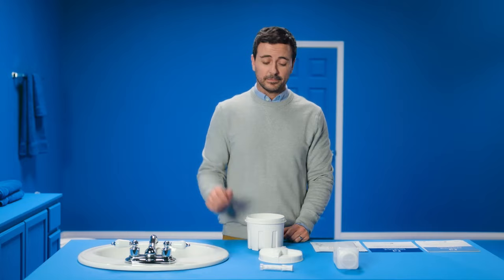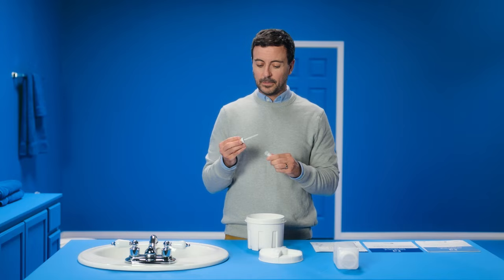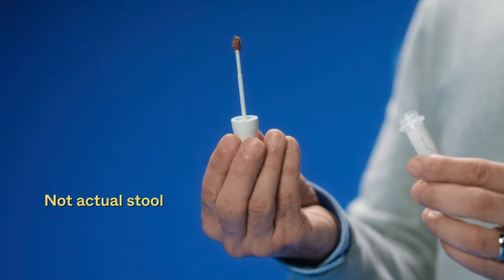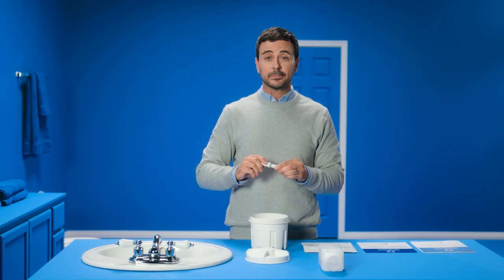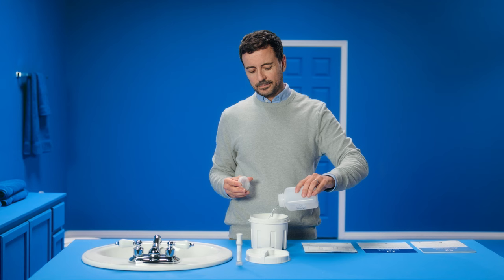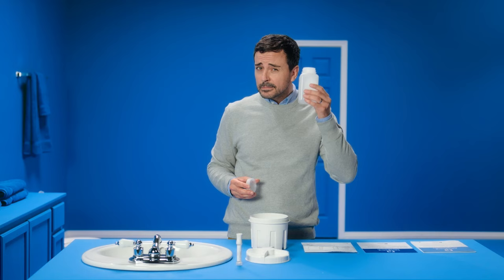Step 4: Grab the small white tube. Unscrew the cap and pull out the probe. Now scrape the surface of the sample until you cover the grooves on the probe. Put the probe back into the tube and screw the cap closed completely. Now empty all of the preservative liquid from the bottle into the container.